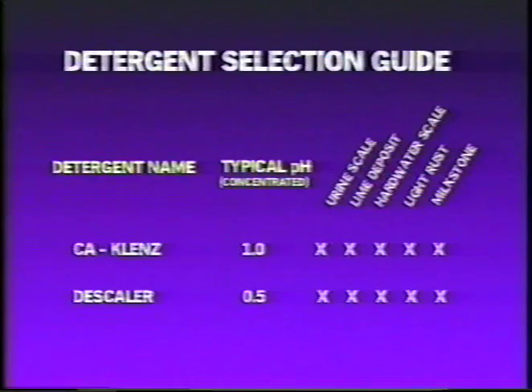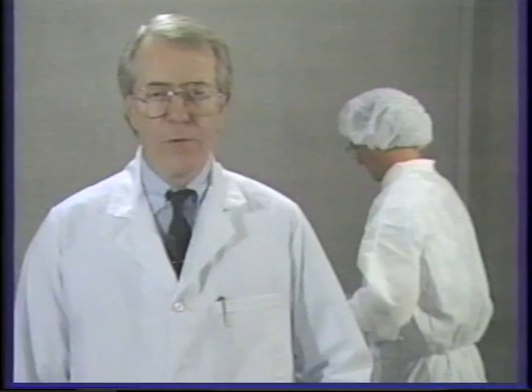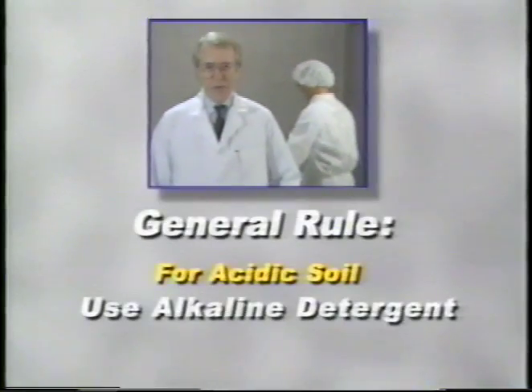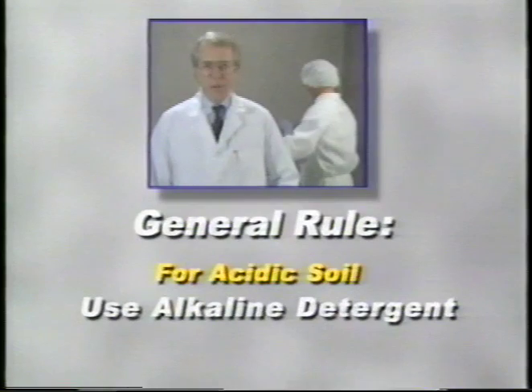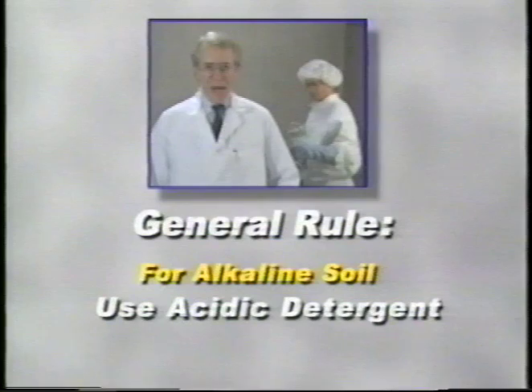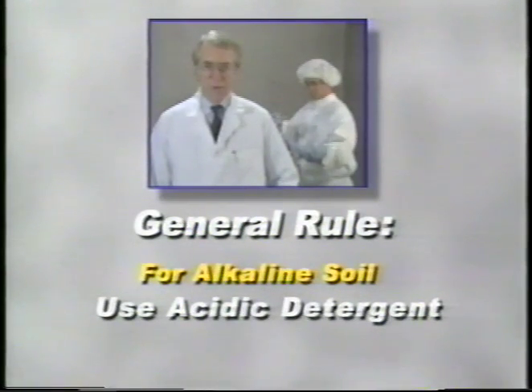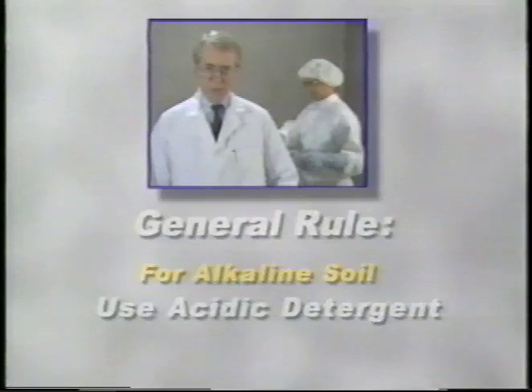In general, the nature of the soil determines the selection of detergent for the washing process. Animal urine scale is removed effectively from cages with an acid detergent. Soil considered to be acidic in nature, such as protein or food substances, need an alkaline reaction to neutralize it. So therefore, an alkaline detergent should be used in those cases. On the other hand, soil rated as alkaline, such as urine scale, needs an acidic reaction to neutralize it. So an acidic or low pH detergent would be the most advantageous in those situations.